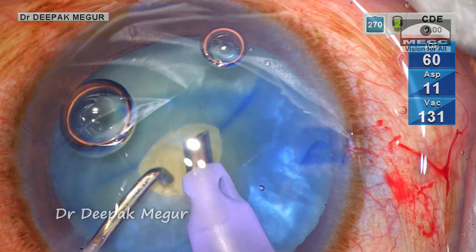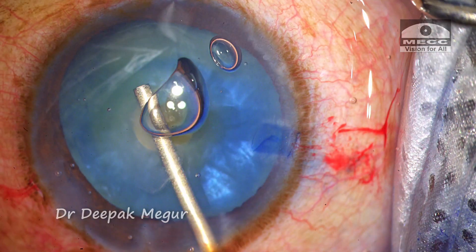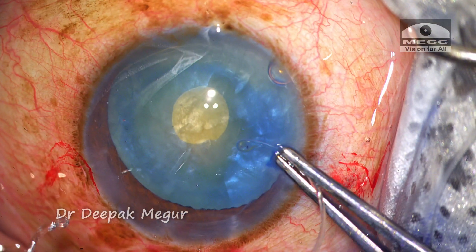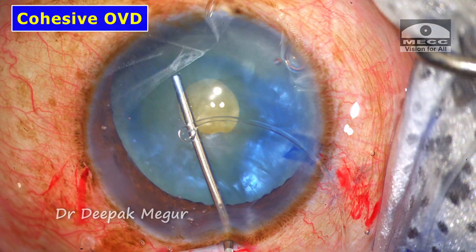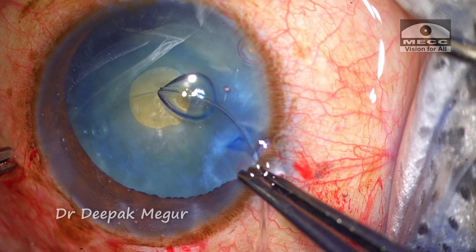The lens tilt is quite intimidating at this stage. I come out, inject OVD to deepen the chamber, then use cohesive OVD to create some space in the bag. The CTR is then gently threaded into the capsular bag.